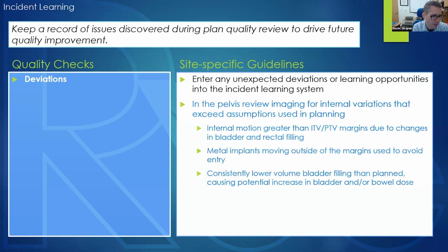HP asks, how do you calculate and evaluate dosimetric constraints for organs at risk when you're treating a simultaneous integrated boost? For example, you have some traditional fractionation, say 2 gray times 38 fractions, and now you have a dose fractionation where you're only treating 30 fractions, and so the SIB is being hypofractionated, the total number of fractions is a little bit different. How do you apply the dosimetric constraints to the bladder and the rectum and other organs at risk when the number of fractions has changed?